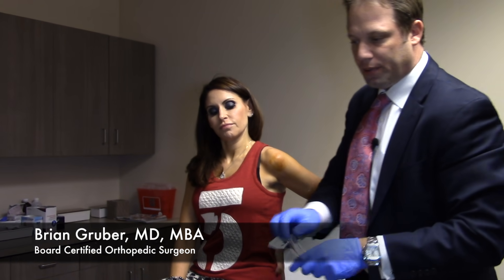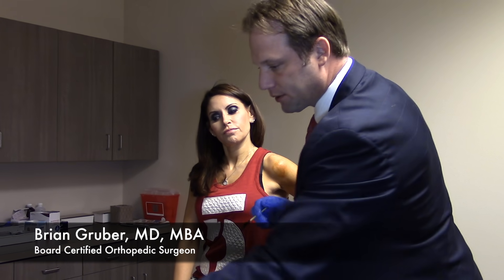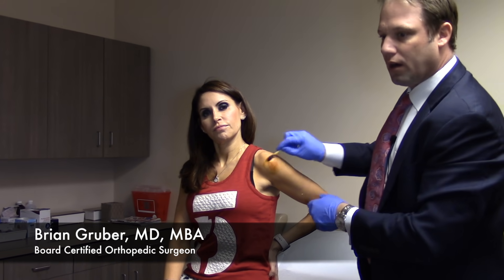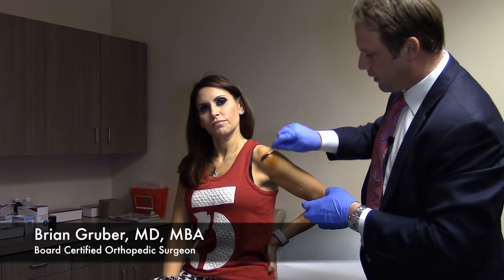For planning out a PRP injection, it's typically about a 30-minute procedure — from the blood draw, to spinning it down, to actually doing the injection — roughly about 30 minutes total.